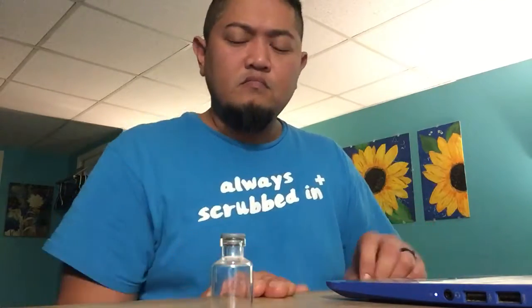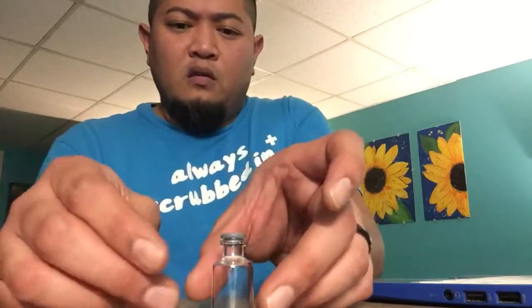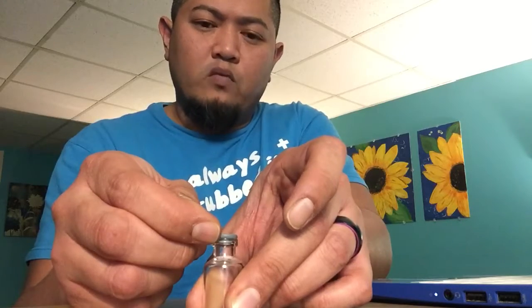We already checked the medication's appropriateness. Vitals are okay. We know the blood glucose level. We know that we're going to give the patient 4 units because of the blood glucose level. Medication is not expired. We are going to draw the medication from the vial. So here's the vial. Make sure it's laying on a clean, flat surface. You're going to pop the either metal or rubber cap.